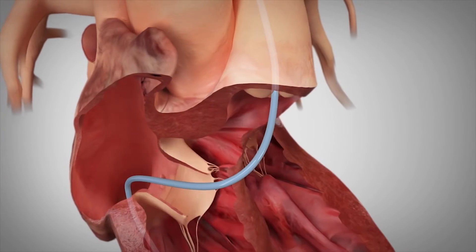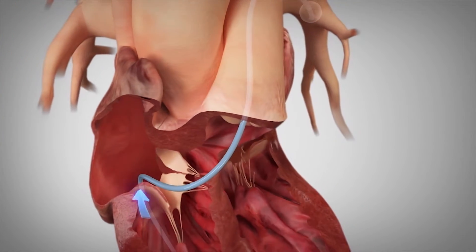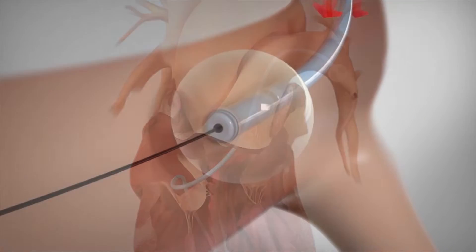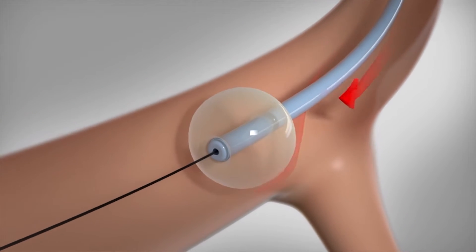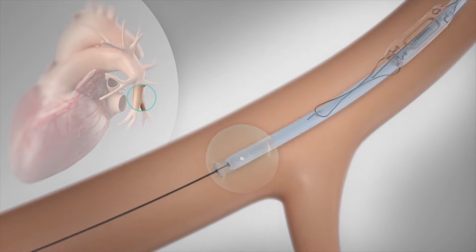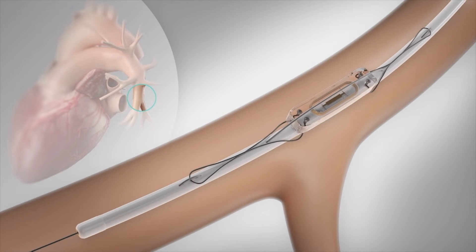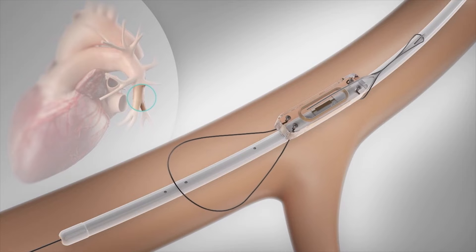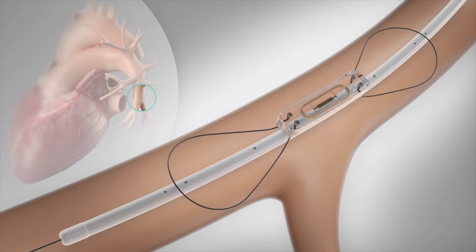The procedure is straightforward. A catheter is placed in the pulmonary artery to determine baseline hemodynamics, along with a selective angiogram to confirm the target implant vessel. The sensor delivery system is advanced over a guidewire to the identified target implant site. Once in position, the sensor is released from the delivery tool and its nitinol loops expand.